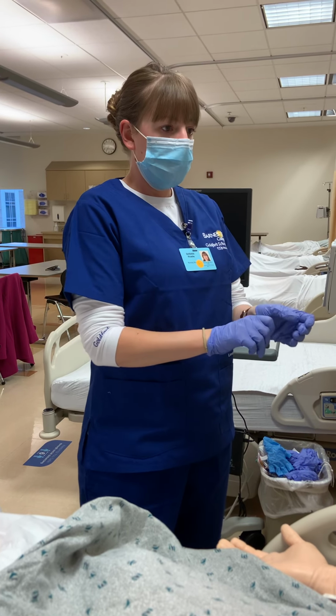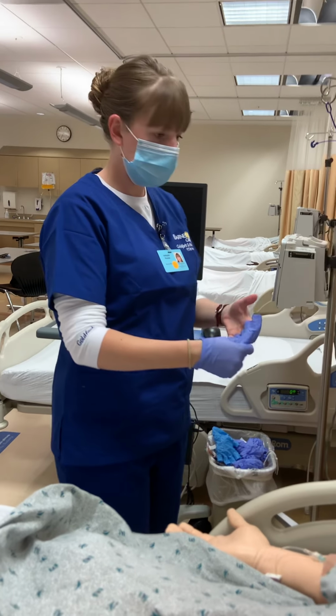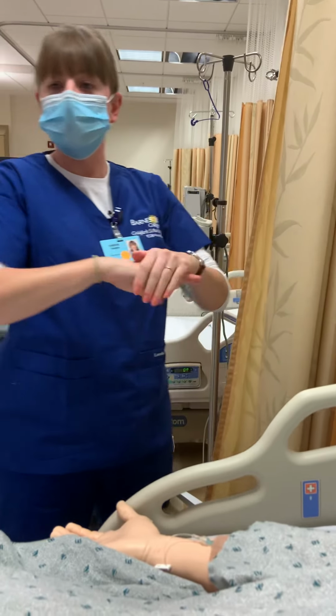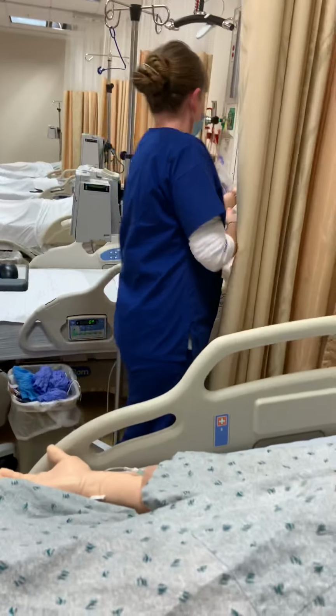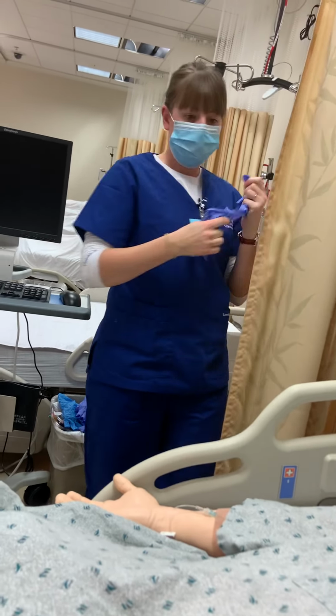So at this point I'm going to change my gloves out. It's kind of different since we're meshing several steps together. Usually they would be all spaced out at different times. But I think if you just document it, it'll be fine.